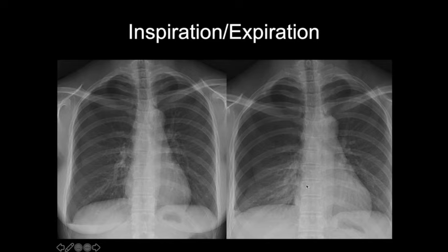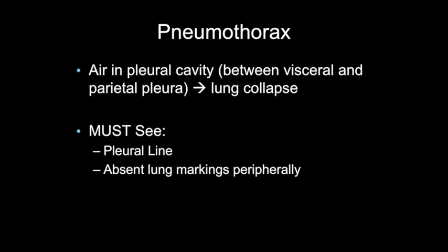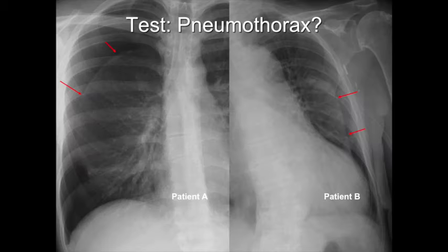On the right side, we have our expiratory views, and the pneumothorax is much more obvious. Again, you have the pleural line and absent lung markings peripheral to it. A pneumothorax is just air in the pleural cavity. To diagnose it, you must see a pleural line and then absent lung markings peripherally. If you follow these two rules, there's really no reason why you can't diagnose pneumothoraces as well as a radiologist.